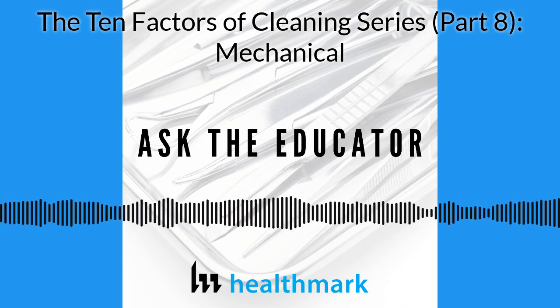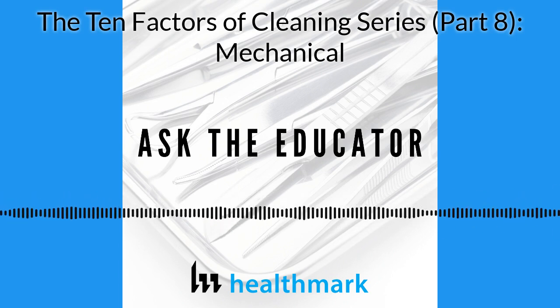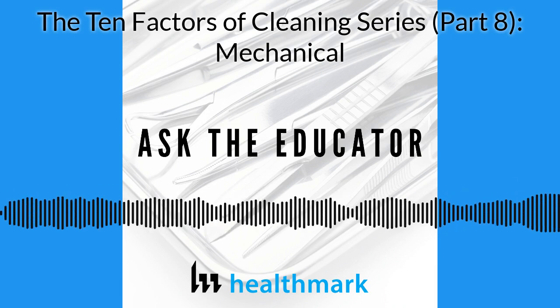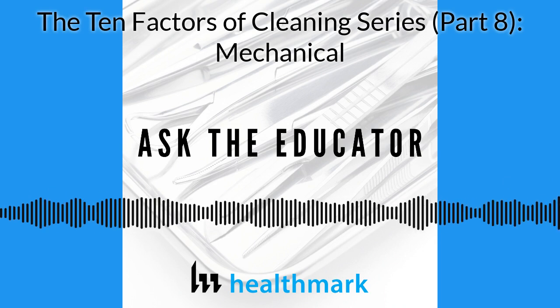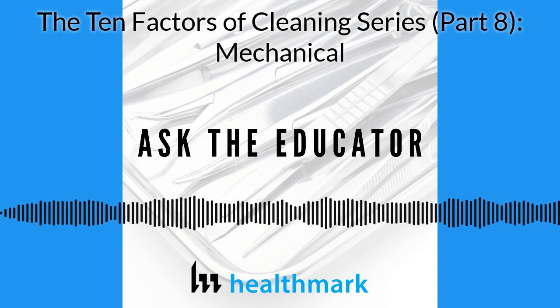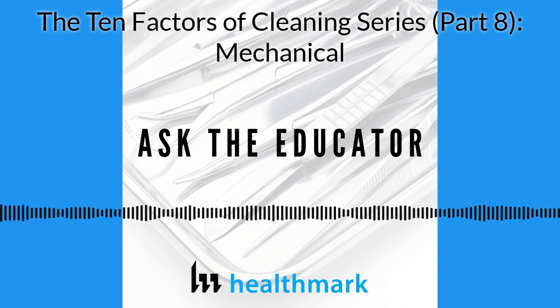Just to recap this episode, Stephen Kovach and I discussed how mechanics is one of the 10 factors of cleaning. We rely heavily on ultrasonic cleaners and automated washers in our cleaning process. But when cavitation isn't present in a sonic, or a spray arm gets clogged in a washer, you can be sure that you're going to have problems with your cleaning. It's important to build into your process a series of quality checks with your mechanical equipment every day they're in use. Simple tests like the TOSI, SonaCheck, or LumenCheck can help you to identify when there may be a problem with your washers and ultrasonics.